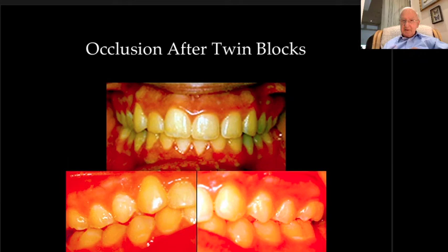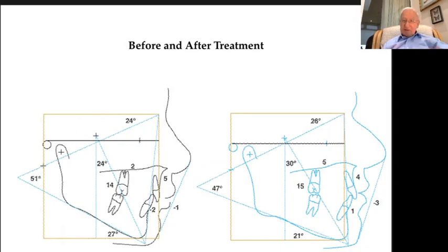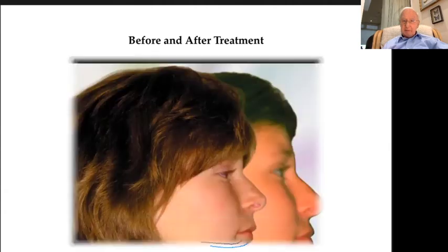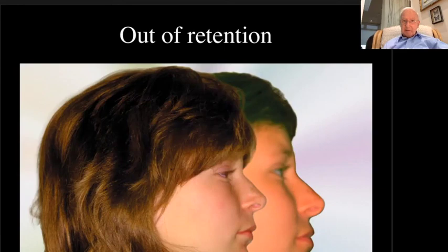The response was positive, and this is the occlusion after the twin block phase. This was heroic treatment. The cephalometric tracings before and after treatment showed the correction achieved to class 1 occlusion with a positive improvement in the profile. The upper incisors are proclined and almost parallel to the facial axis. The lower incisors are in a stable position 1 millimeter ahead of the APo line after treatment. The superimposed tracings confirm that the profile improved by mandibular advancement. This is confirmed in the facial photographs. A combination of lingual arch development and mandibular advancement produced a positive response in the occlusion and the facial profile.